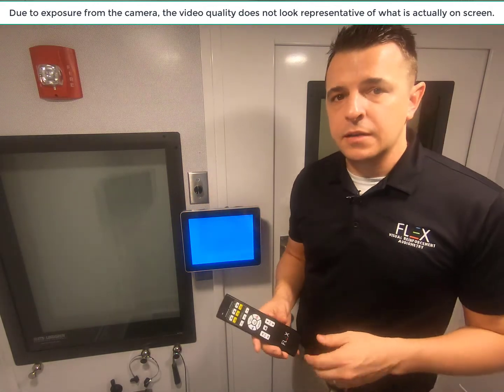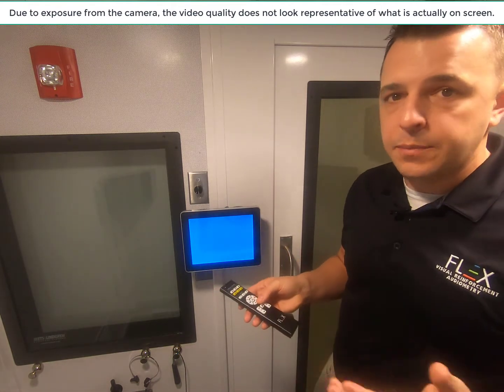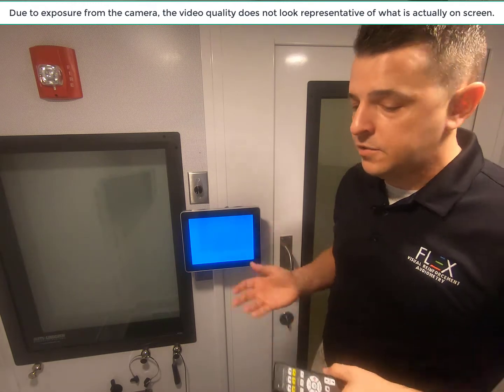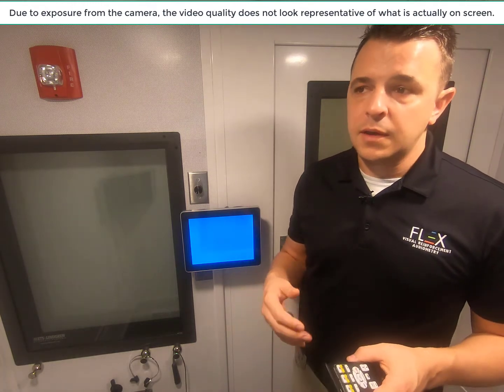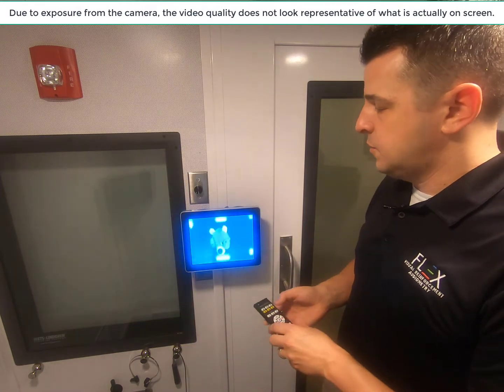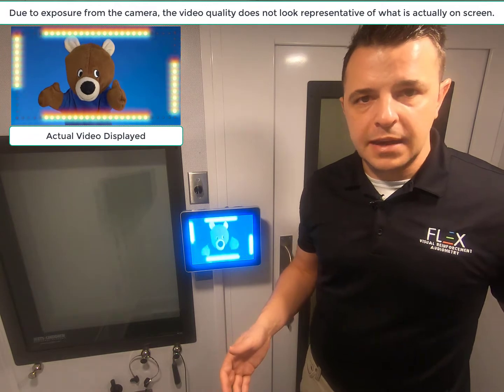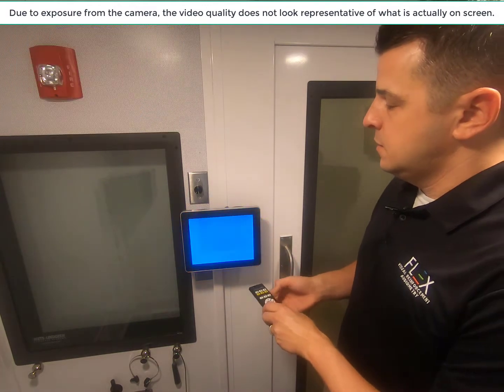Another feature we put on here that's also available on the traditional Flex VRA is we kept the distract feature on there. So if you bring a patient in and you want to do otoscopy, OAE, or tympanometry and keep them still, you still have that feature available here on the Flex Basic. Put your remote off to the side, and then when you're done, you can turn that stimulus off.